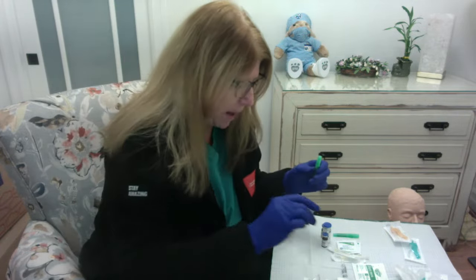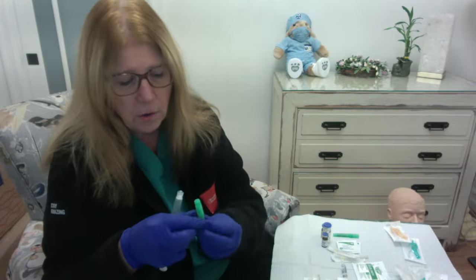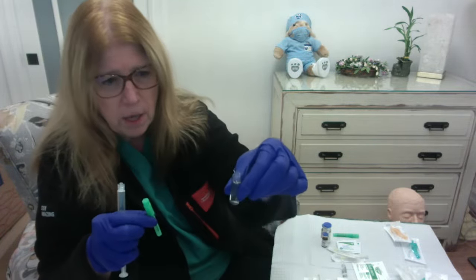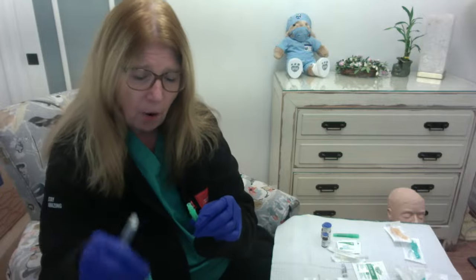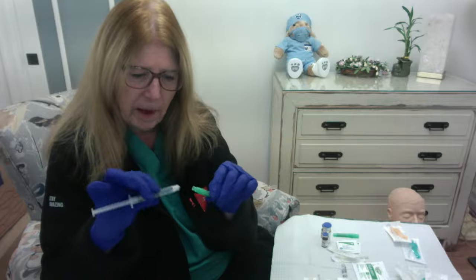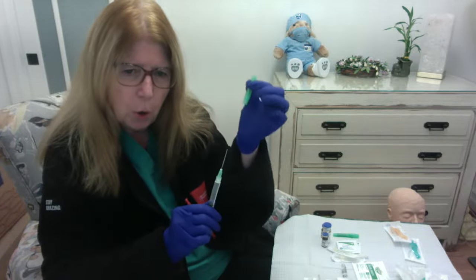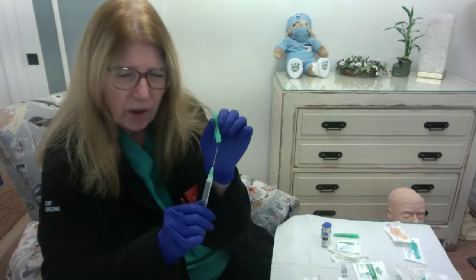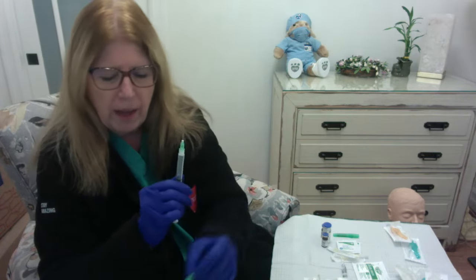Let me grab my 3 milliliter syringe, because what I have here in the ampule is 2 milliliters. I'm going to take the cap off of here, and I'm going to attach my two hubs together, and then I'm simply going to pull off the cap. Don't twist the cap off because that loosens your needle. So you just want to lift the cap off.